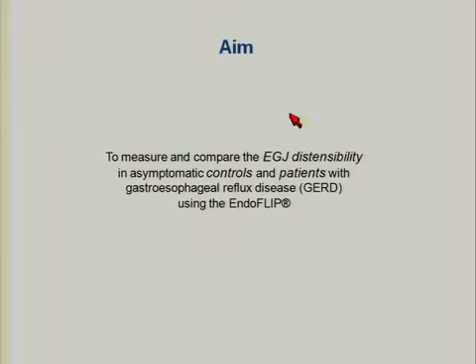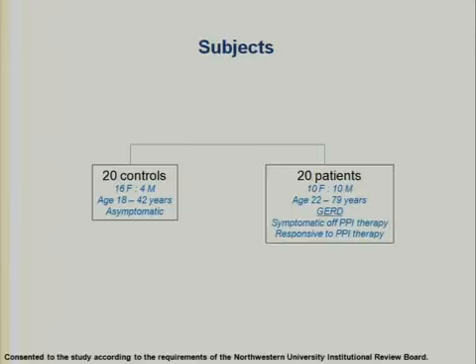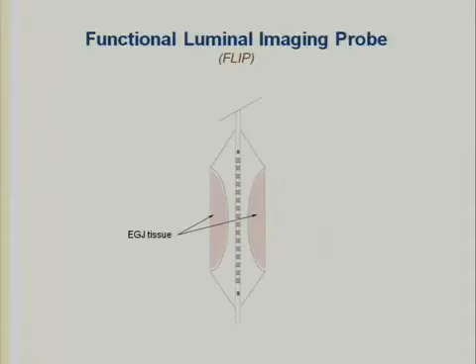So what we wanted to do is to measure and compare the EGJ distensibility with a new tool that's using this technology in controls and in patients with gastroesophageal reflux. For that purpose, we enrolled 20 controls and 20 patients with GERD who were symptomatic off PPIs, but nevertheless were responsive to PPIs. This is a schematic of the probe itself.